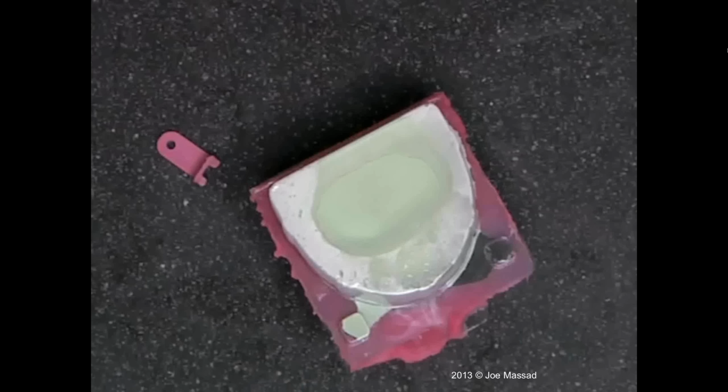It's amazing because in our office we actually at one time calculated cleaning up and sterilizing, cleaning up laboratory was about 13%. Oh my gosh, that's amazing. So if you're going to do this in your office, which I highly recommend that dentists begin to pour these up in your office, because especially on a removable case, what can you do? You can actually make your bases right then. So I actually will make my impressions, pour this up, and within 20 minutes I'm making my bases, and I go take records.